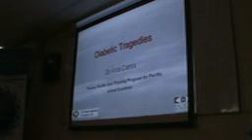As you know, the camera has images, and those images can be stored. So the advantage is you can actually show your patient then and there diabetes damage in that patient's eye. So when you're explaining the type of retinopathy they have and how severe it is, you can actually show them the photo, and they will be able to understand it a bit better.